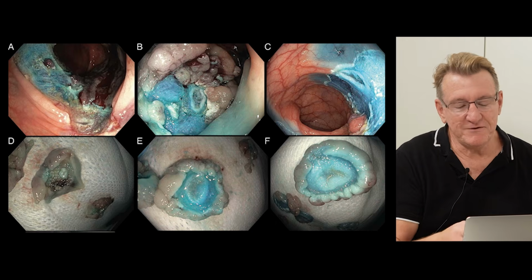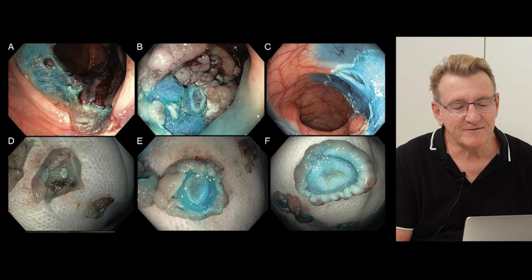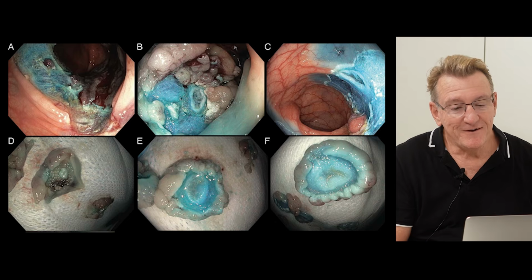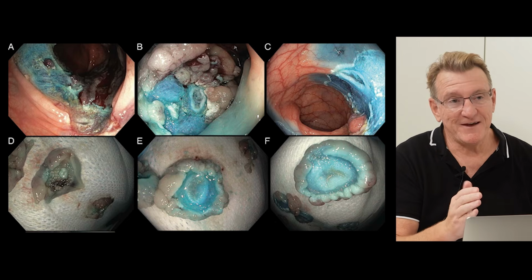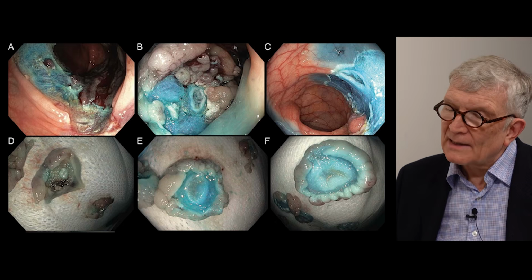To satisfy your curiosity, if you use the water jet on that and put a bit of gas, it'll open up immediately or after a few minutes. Is that the Burns syndrome? The post-polypectomy syndrome? No. Maybe that's from the old days.